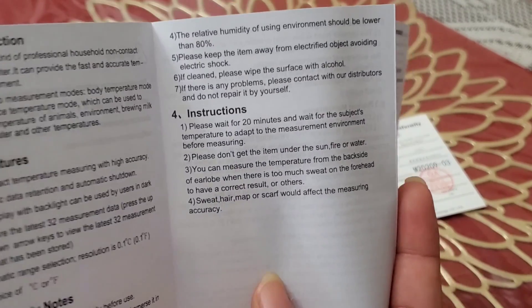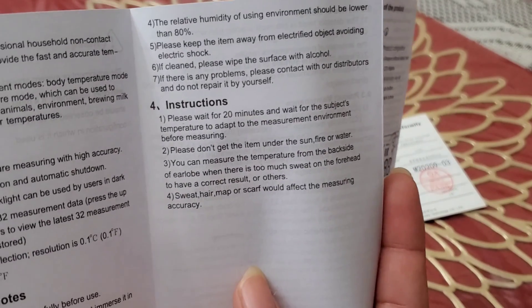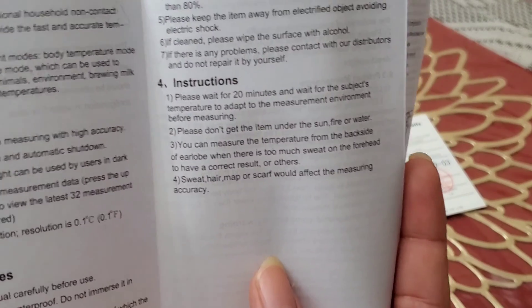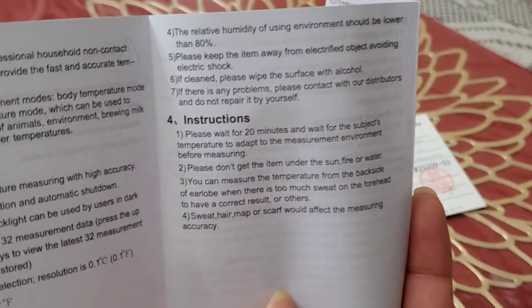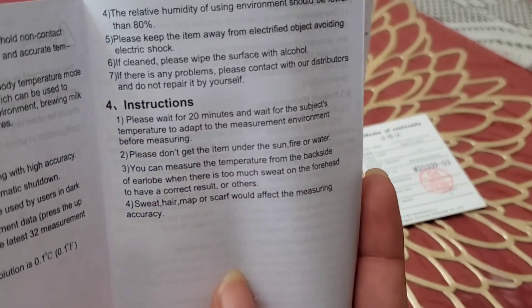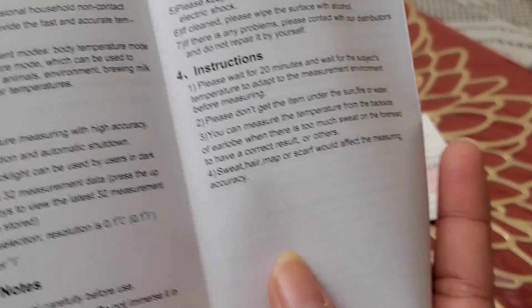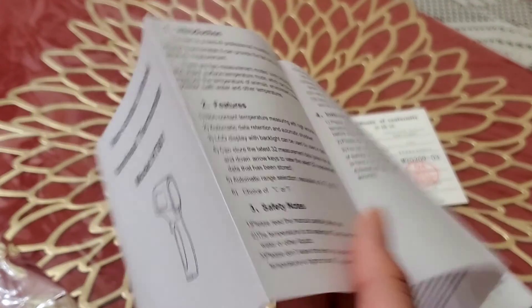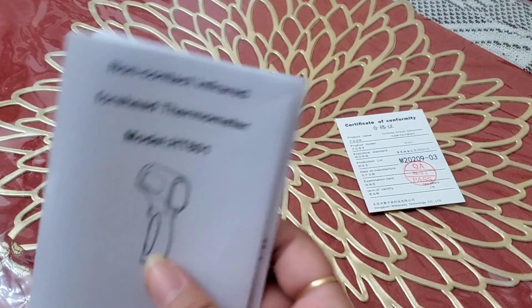Here are the instructions for how to use it. One thing you need to make sure before using the thermometer is that you let the person or object be in that environment for at least 20 minutes before measuring. It also says please don't get the item under the sun, fire, or water — this is not waterproof. It also says you can measure the temperature from the backside of the earlobe when there is too much sweat on the forehead, which is convenient if someone is sick or having a fever. There are also safety notes about how to store and keep the thermometer.